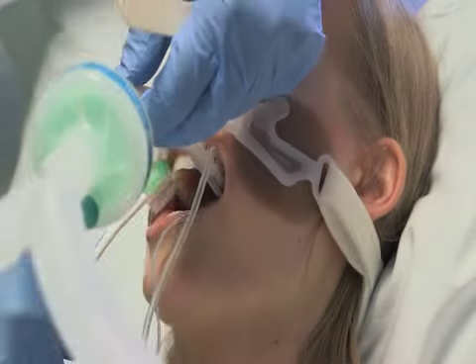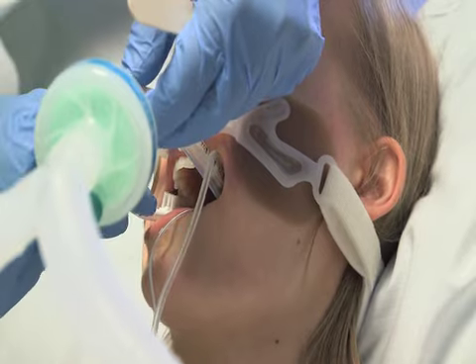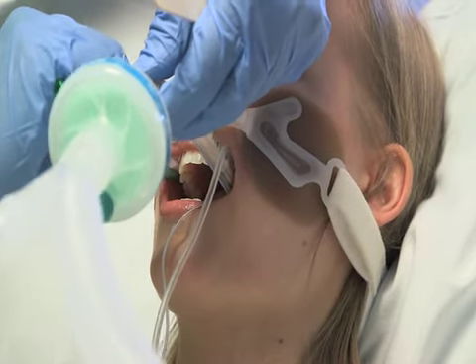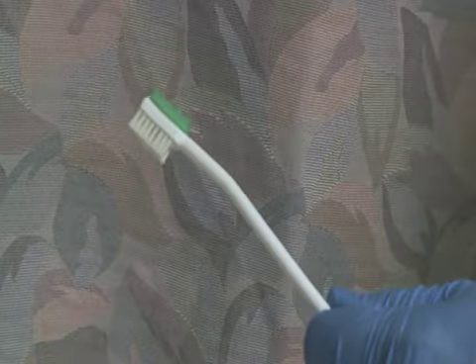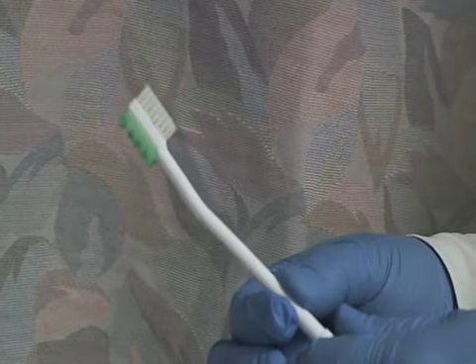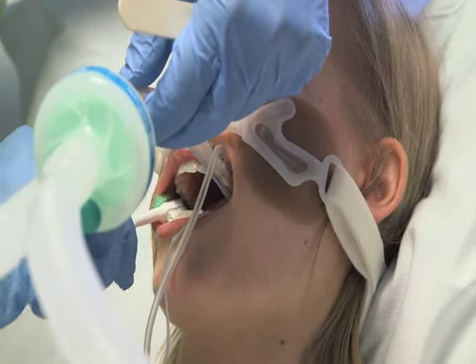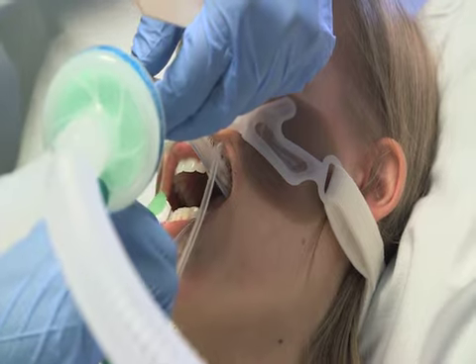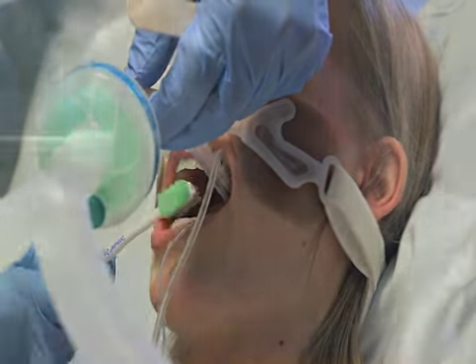A critical component of an evidence-based oral care bundle is the prevention of biofilm formation through toothbrushing. The use of a soft bristled brush can reduce biofilm formation even below the gum line. The modified Bass brushing technique being demonstrated here is the most effective method for mechanical removal of dental biofilm.